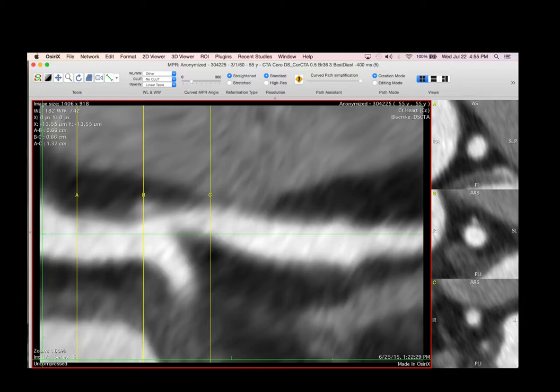Okay, so last class you guys covered a couple applications for CT in the cardiac space. You spent a little bit of time looking at the diagnostic task of is there a stenosis in a coronary artery vessel. Now that you can capture an image, and you had slides about how you can do it at high heart rates, you can do it in a single beat. I think your presentation will talk about how long it takes to make a scan.